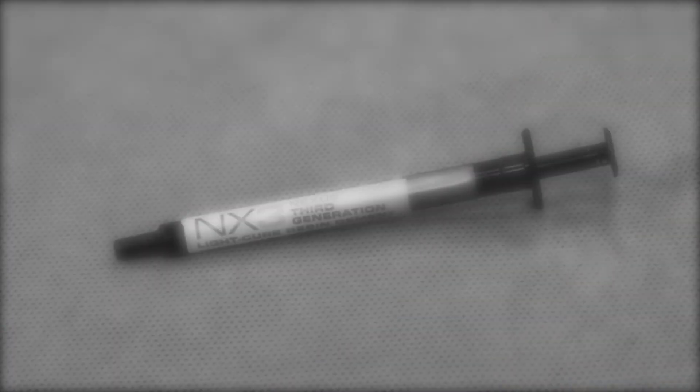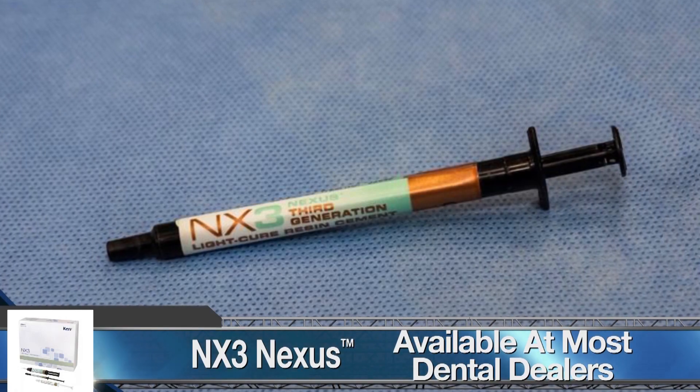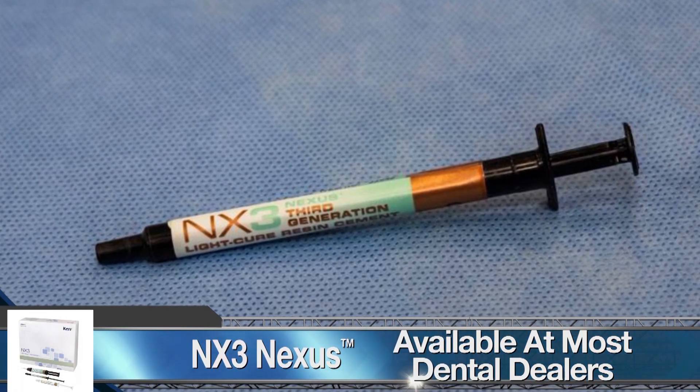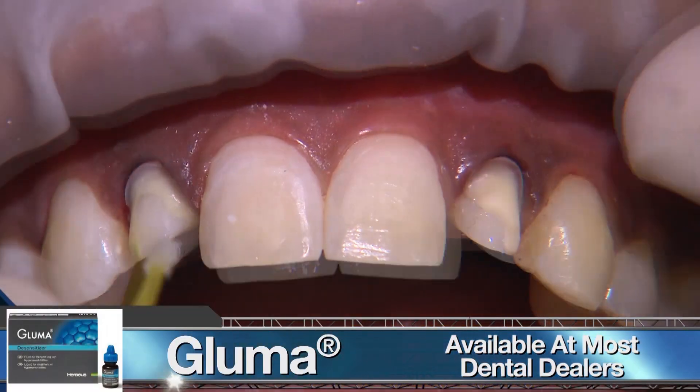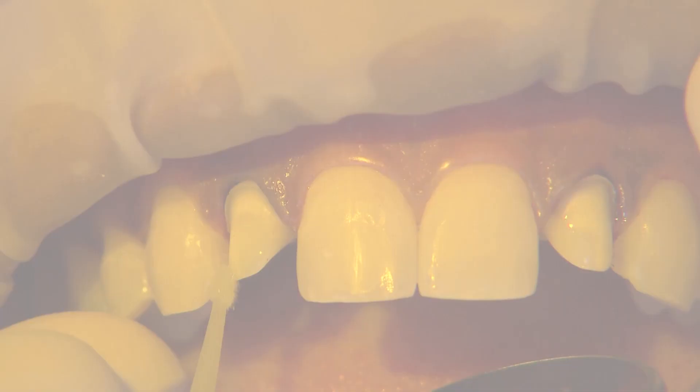I recommend using an adhesive resin cement with more translucent restorative materials, like Bruxer Aesthetic, in the anterior. To disinfect the preps, I apply a very thin coat of gluma, carefully avoiding the soft tissue.